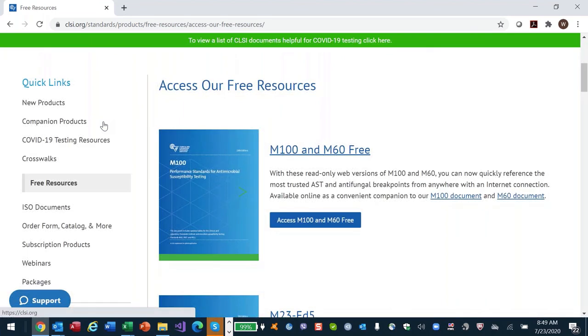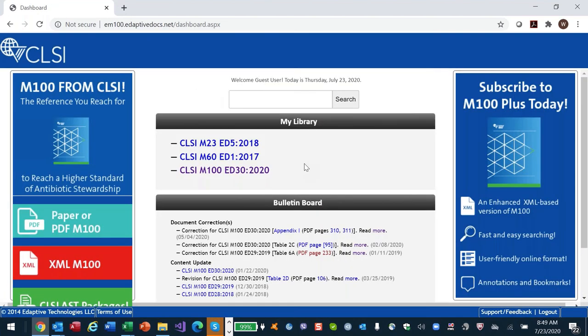Let me open that up. And you do not need a login, no money, no password. This document is free. On the left, it says TOC, table of contents. And let's jump down immediately to table 2A. Well, okay. At the top, very valuable overview of changes from last year. So if people do not have the money to buy this document every year, they can look at it. And even if you do have the money, you still want to just know what the changes are.